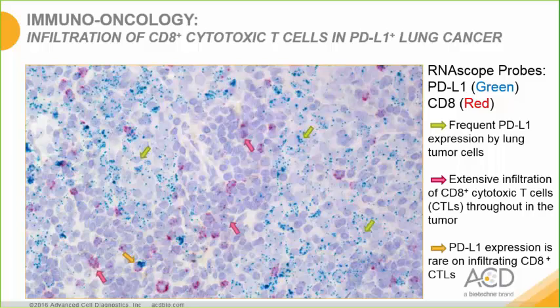Scattered throughout the tumor are CD8 positive cytotoxic T cells marked by the red signal, most of which do not co-express PD-L1. However, there are occasional cytotoxic T cells with PD-L1 co-expression, indicated here by the orange arrow.